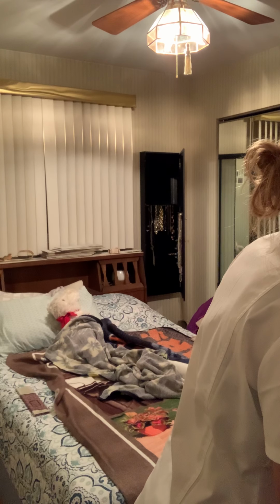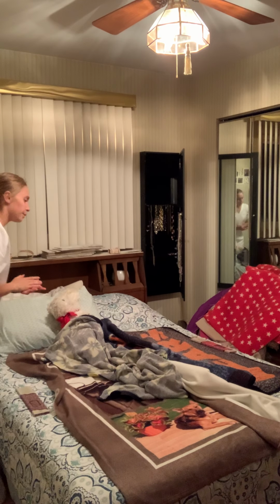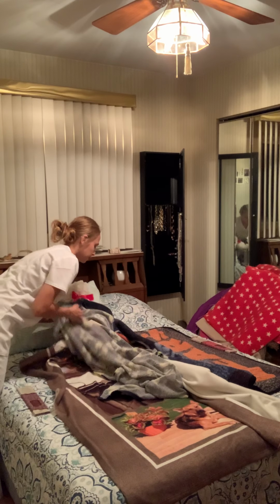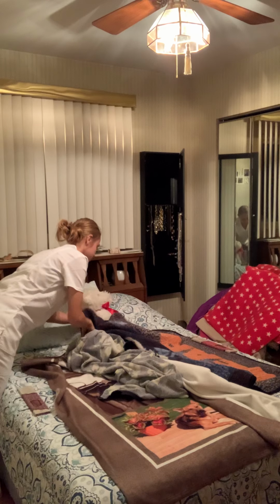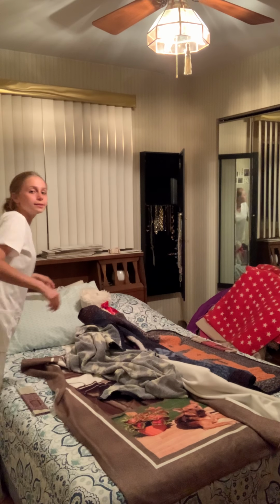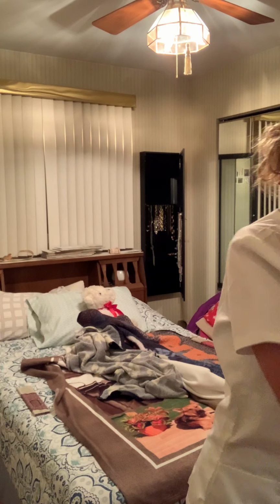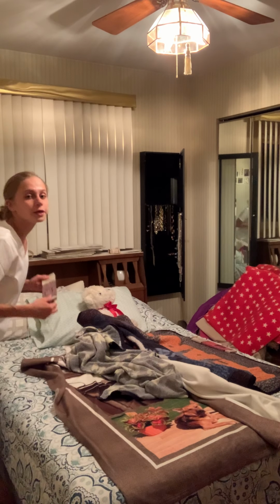So we are going to be helping the person roll over on the other side, and they are going over the bump, and now adjust the pillow to their liking, to their comfort. Then I'm going to be lowering this bed rail because I will be working on that side now.